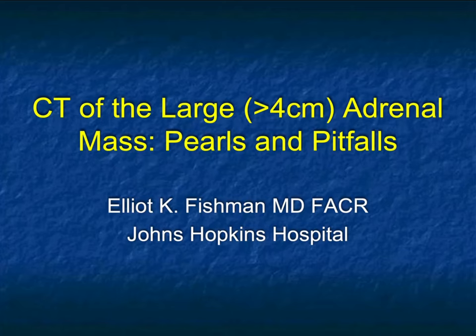We also had a talk on large adrenal masses, with large being 4 centimeters, and I spoke about some of the challenges we have, particularly in distinguishing. We always worry about malignancy like adrenal cortical carcinoma from other lesions. And again, this 4 centimeter size is what people typically call large adrenal masses.